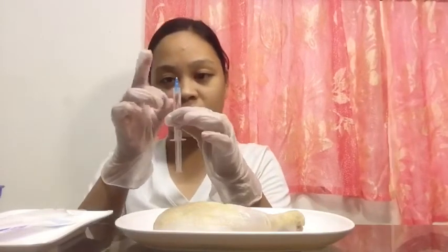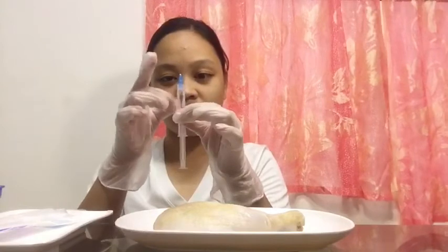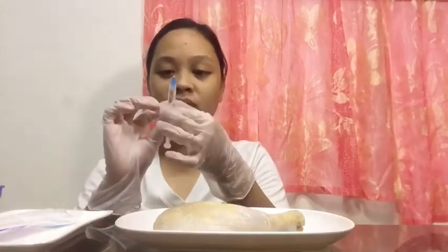Next, prepare the syringe. Make sure to inject the medication using the Z-track technique at a 90-degree angle.